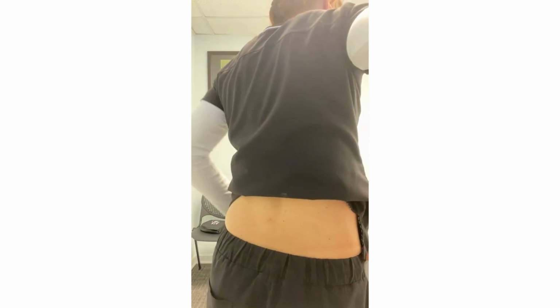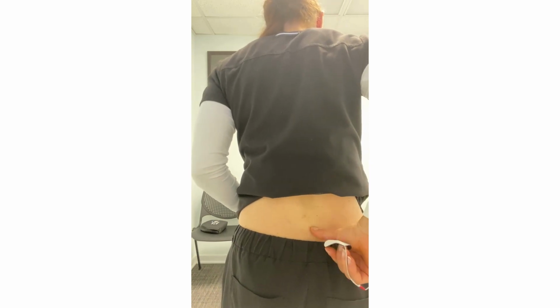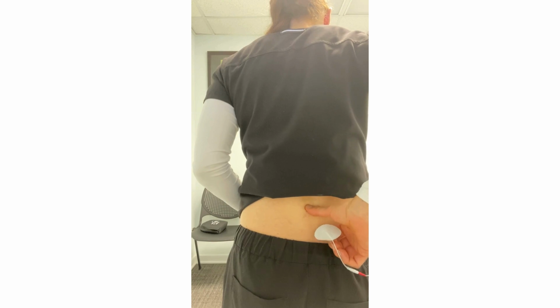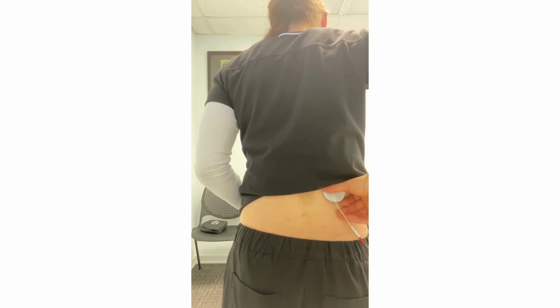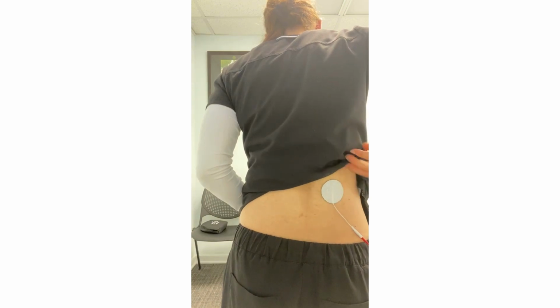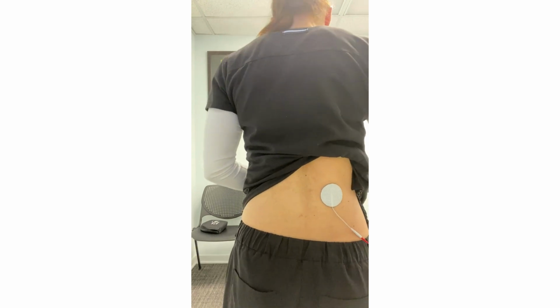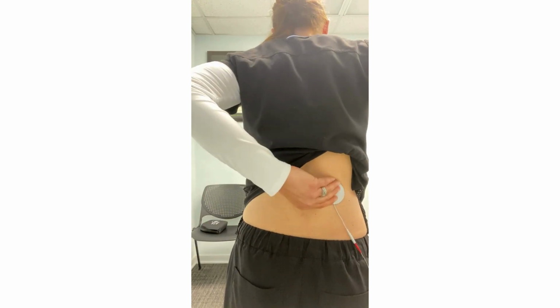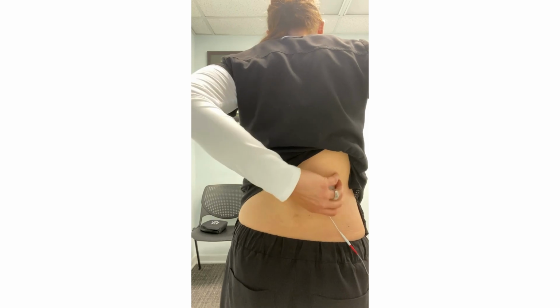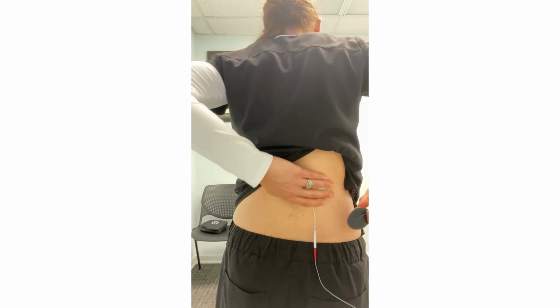And I am going to simply, let's say I have pain right here. You can see the line is where my spine is. If my pain's right here, I'll go just above on the side and put the pad down, make sure the fabric of my shirt is not in the way. And then, again, to be discreet, we're going to try to, let's pull that over a little bit. That feels a little too lateral. So you're trying to get in the bulk of the muscle because that's what you're treating.